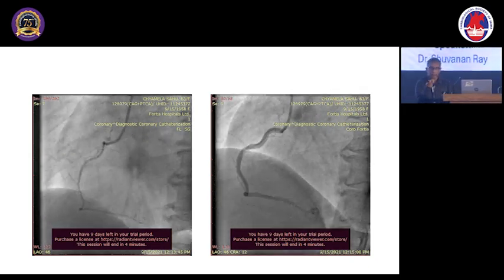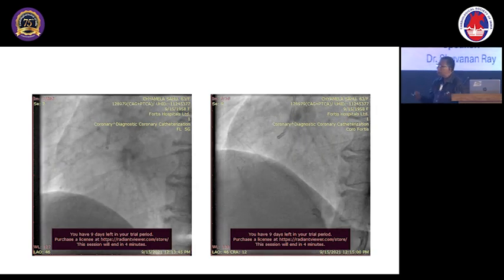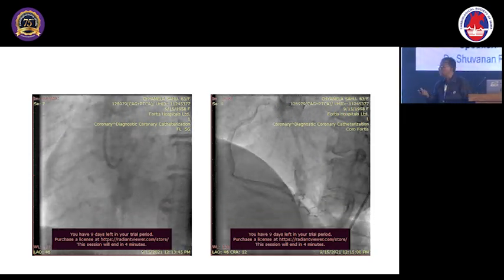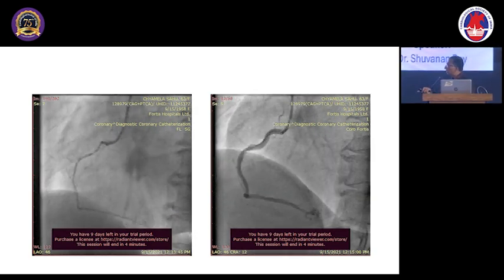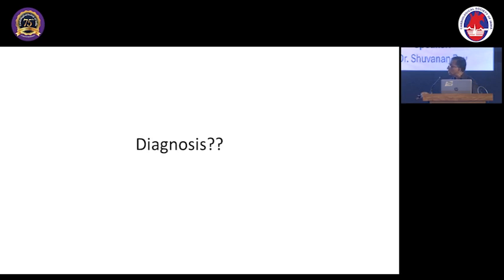It is important to see that the gentleman did everything but missed one thing. He was doing it without hemodynamics, so whether there was damping, he did not notice. And this is a case of spontaneous coronary artery dissection. In SCAD, sometimes you can go into one of the planes which will have an almost normal looking lumen, but it is not normal. If you look at it, the dye is holding there, till the catheter is out. So it is the false lumen.